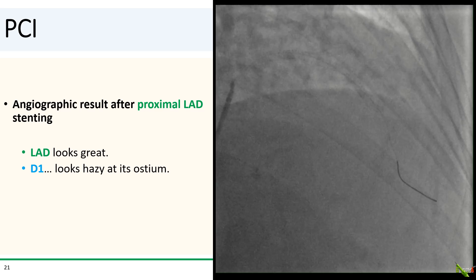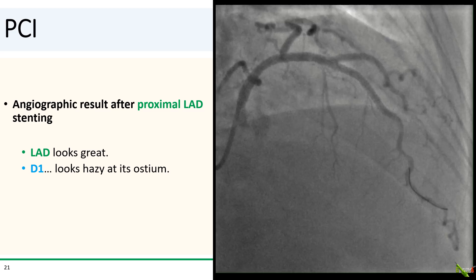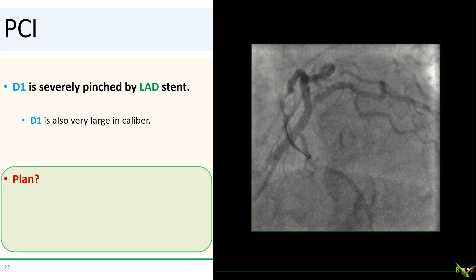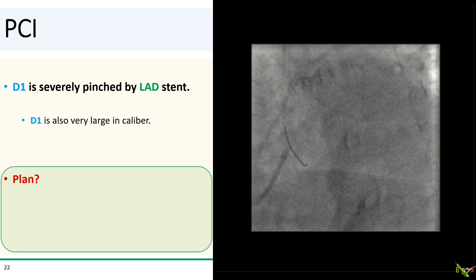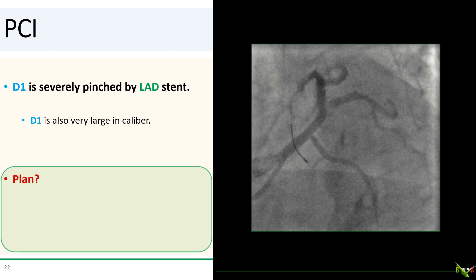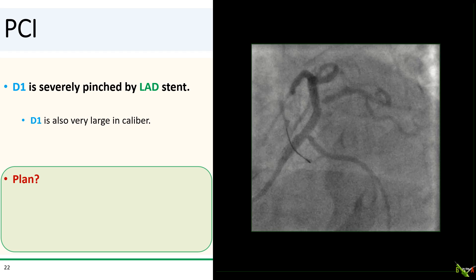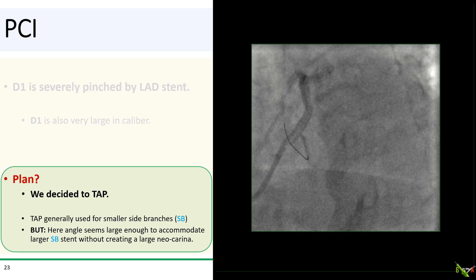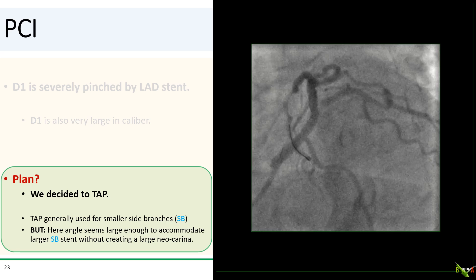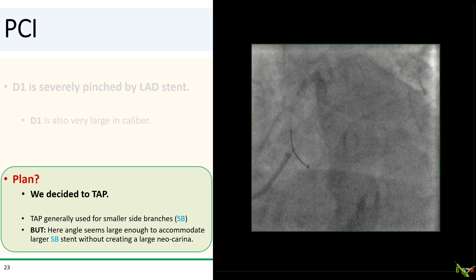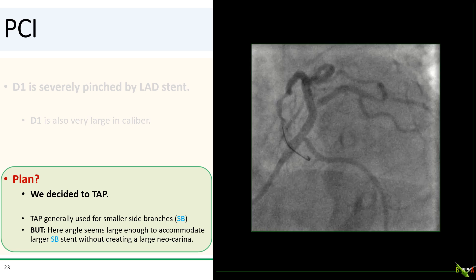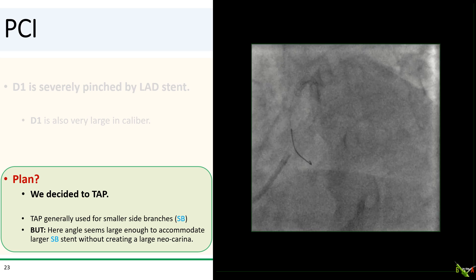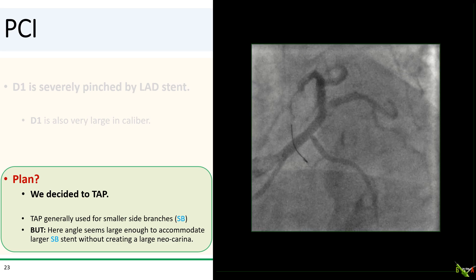Here is the result after proximal LAD stenting. The LAD looks great, but D1 does look a little bit hazy at its ostium. In this view, you can see why: D1 is severely pinched by the LAD stent, and it is a pretty big vessel. So what's our plan? Should we do another culotte? We actually decided to try TAP. TAP is generally used only for smaller side branches to avoid a large stent neocarina — that is very true — but here we thought that the bifurcation angle was large enough so that even a larger stent in the side branch would not create a tremendously large neocarina. So we thought this bifurcation could be suitable for TAP.